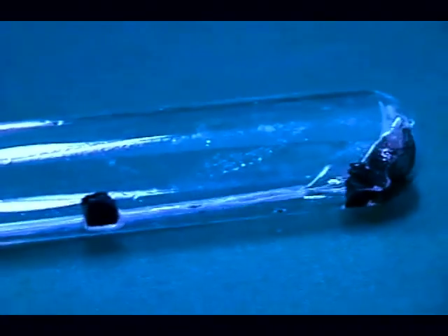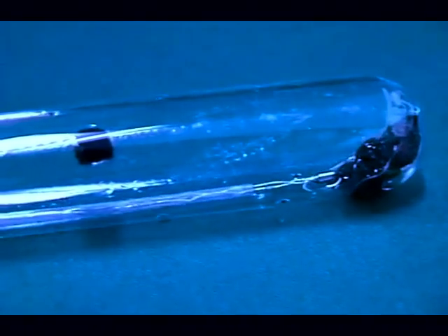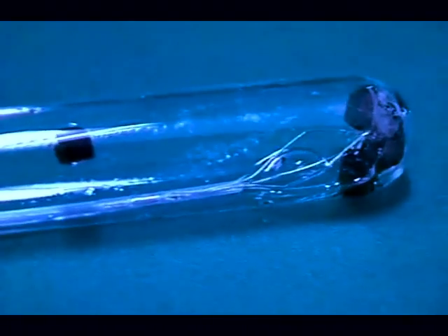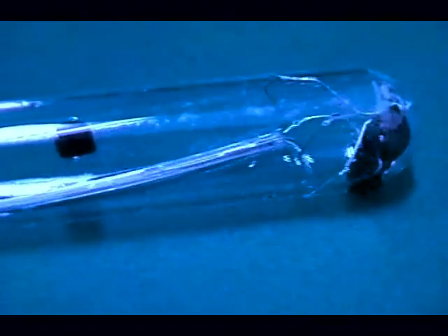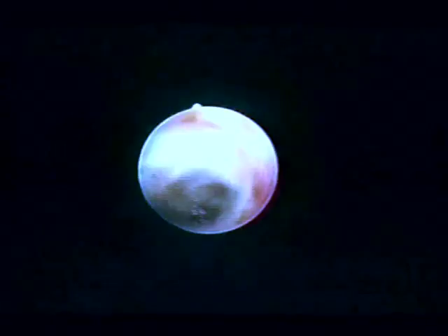When the stones are located in the dilated terminal branch duct, basket stone removal can be very difficult. The shape of the basket is easily deformed because there is no space at the posterior side of the stone. If we inject normal saline forcibly into the terminal duct, it makes a whirling movement of stones, and sudden retraction of the cholangioscope causes outward flow of normal saline from the bile duct. Small stones and debris can come outside of the body with this flow.